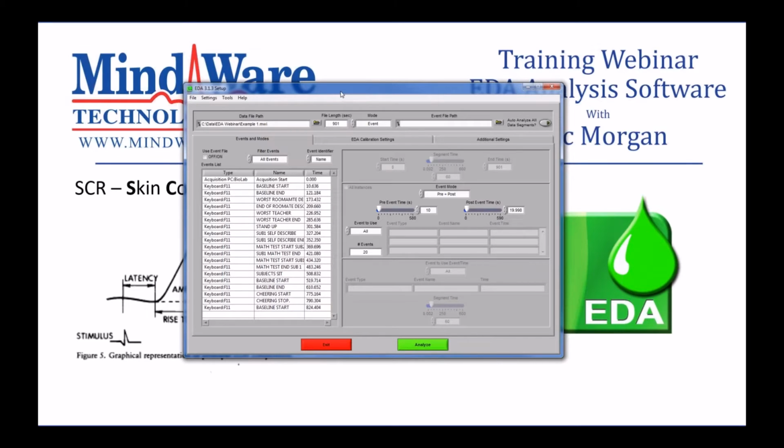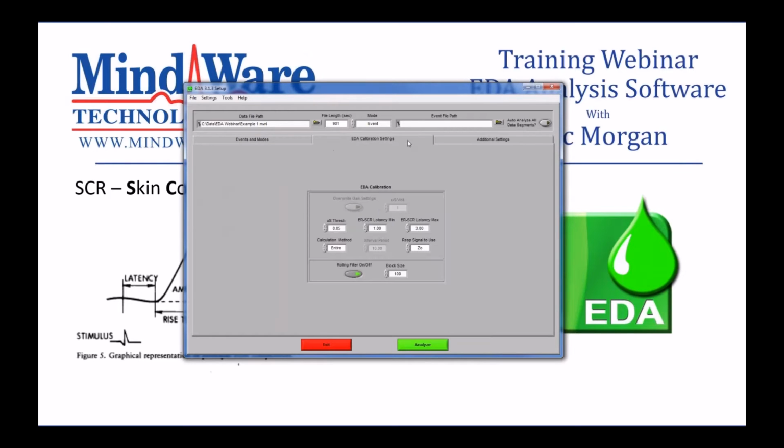So for my first example, I'm going to be analyzing in event mode, and I'm going to be looking 10 seconds before each event and 20 seconds after each event. And if you have any questions on this, feel free to submit them to the questions log, and we'll have time to talk about it a little later in the Q&A portion. So I'm going to quickly move to the EDA calibration settings tab. This is the tab where you're going to set up all of the parameters that are specifically about EDA analysis.